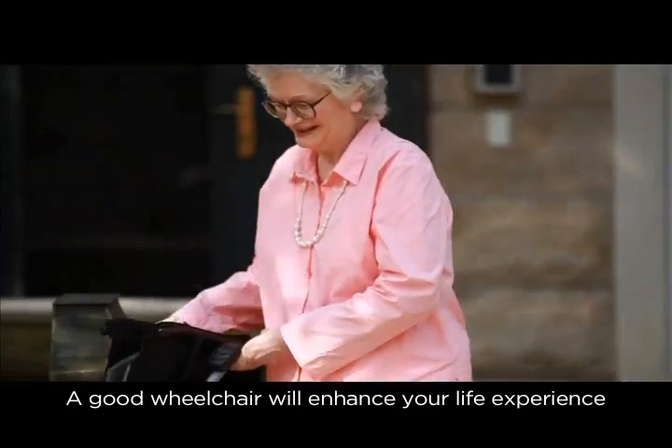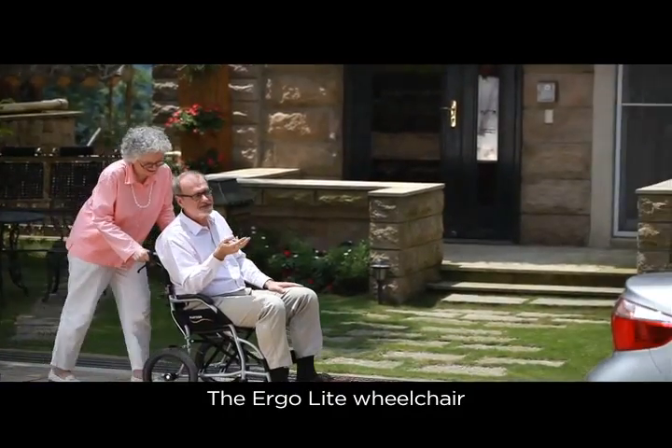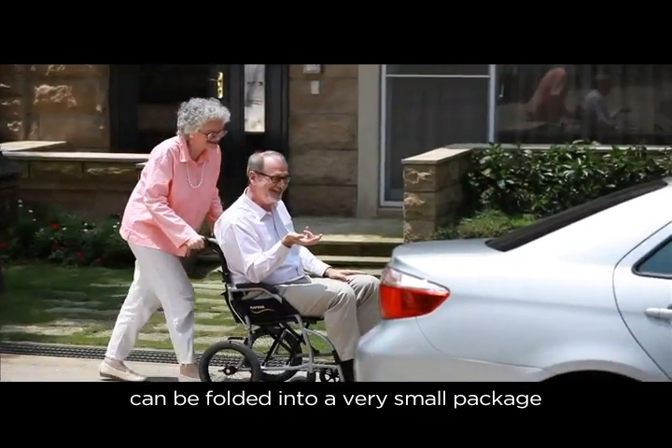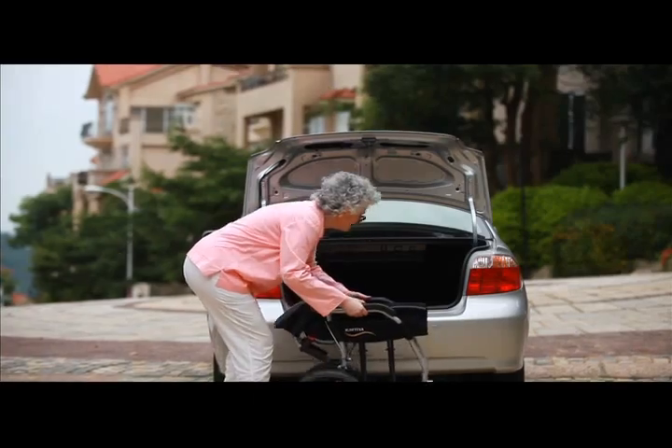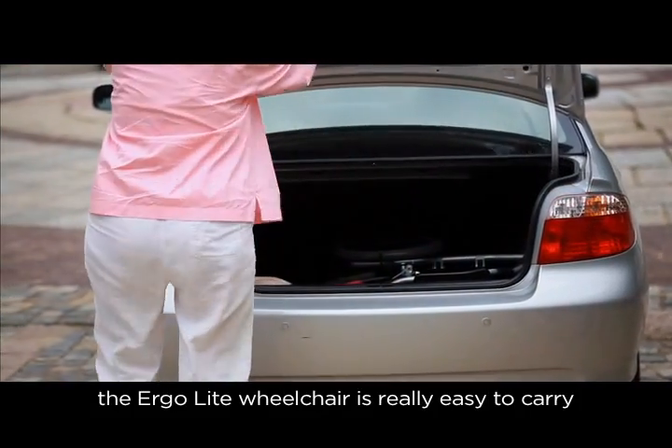A good wheelchair will enhance your life experience. The Ergolite wheelchair can be folded into a very small package. Being ultralight, the Ergolite wheelchair is really easy to carry.